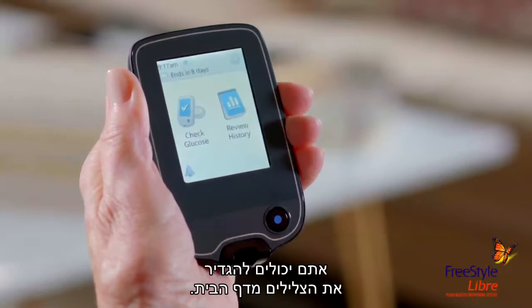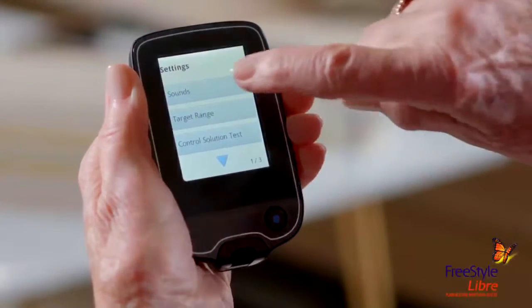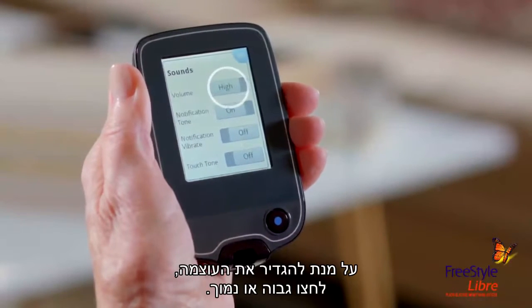From the home screen, you can set the sounds. Tap the gear for settings. Choose Sounds. To set the volume, you can tap High or Low.